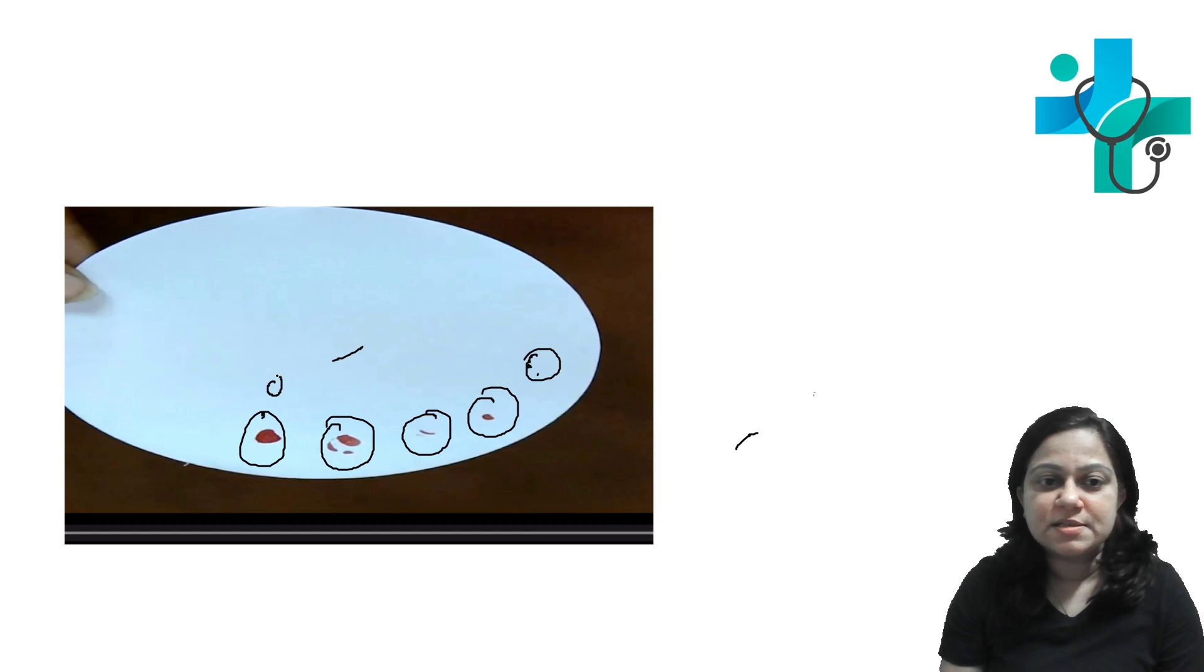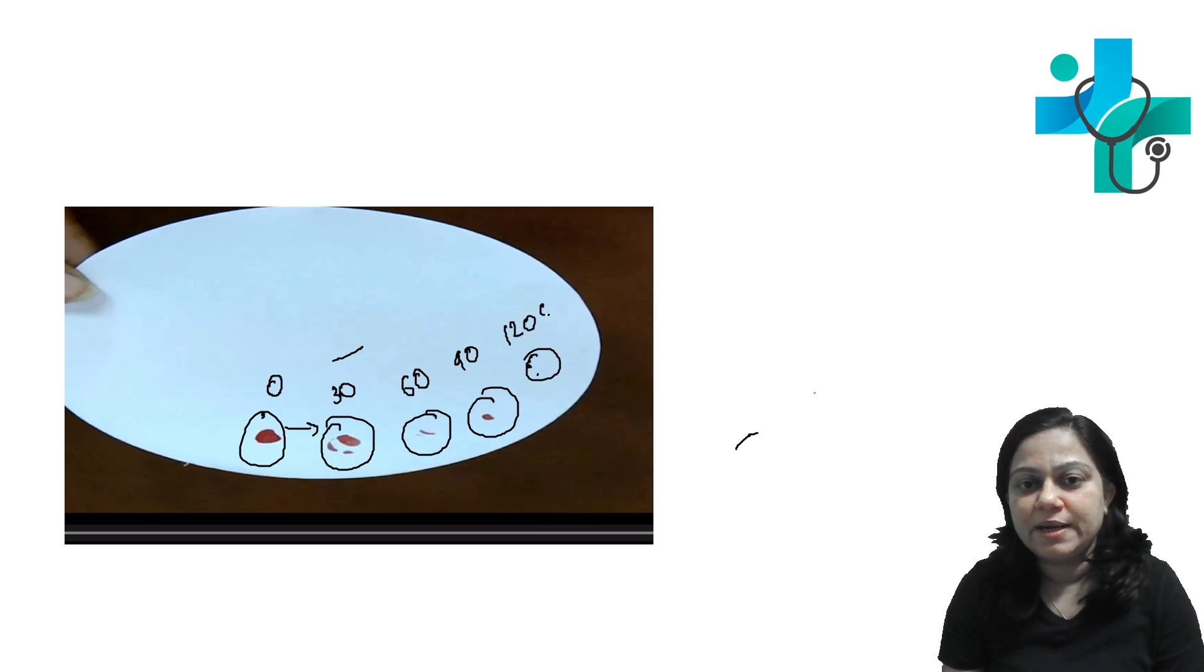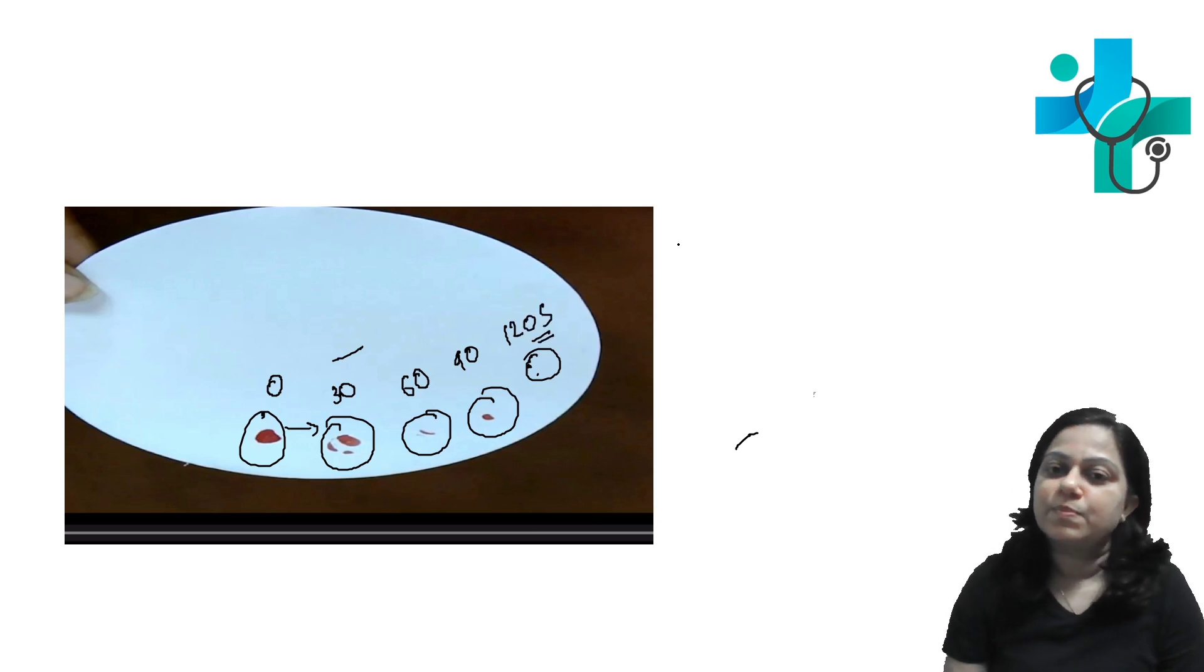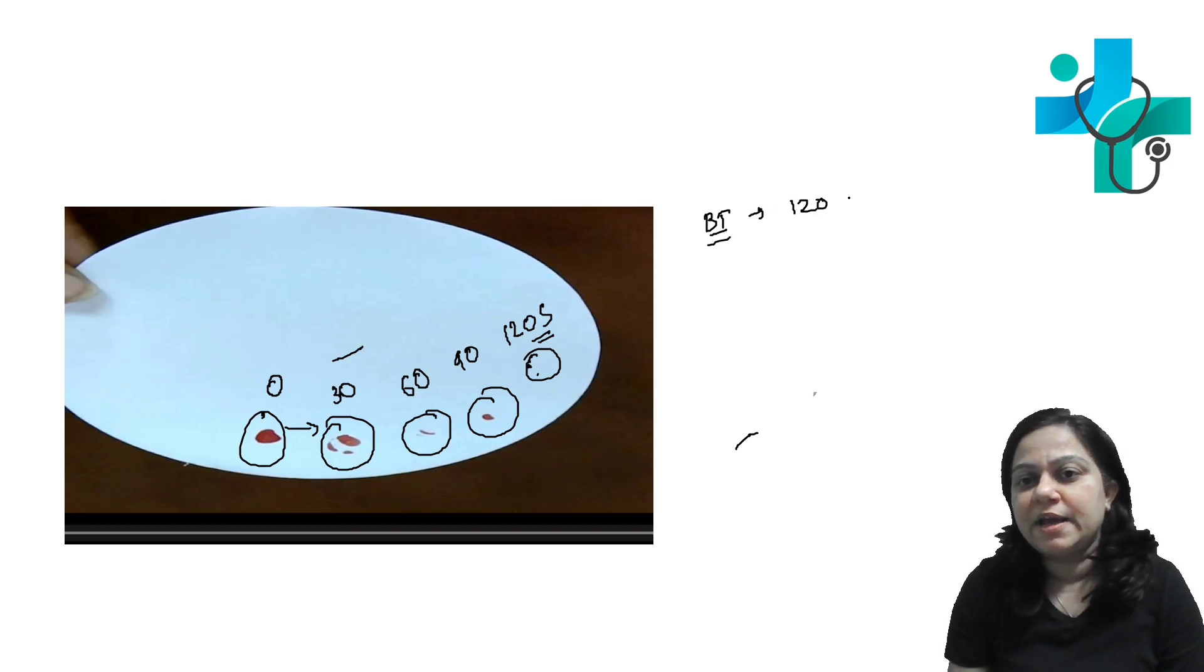This is zero time. Then at every 30 seconds - after 30 seconds, again after 30 seconds means this is 60 seconds, then 90 and 120 seconds. So bleeding time here is 120 seconds.